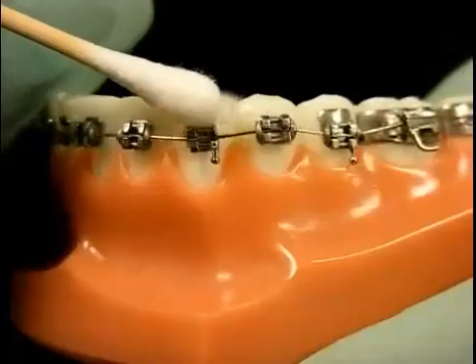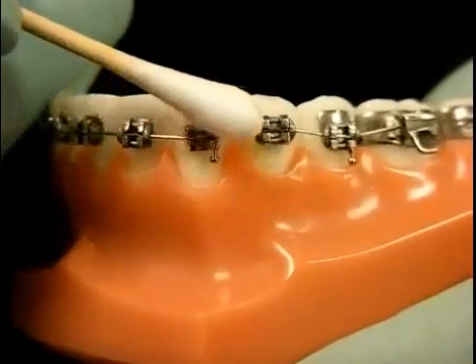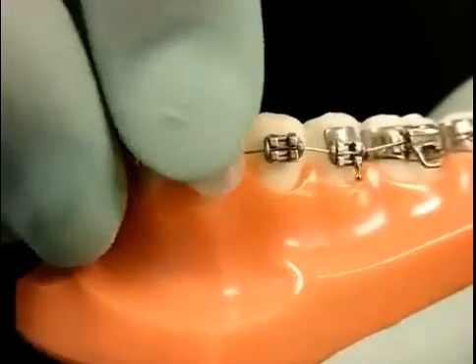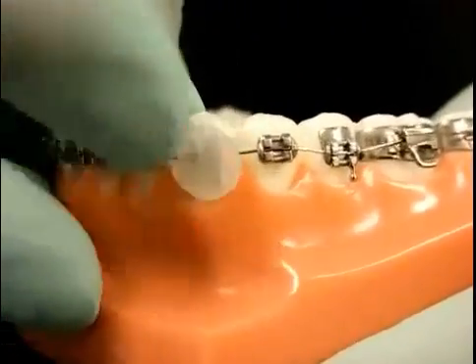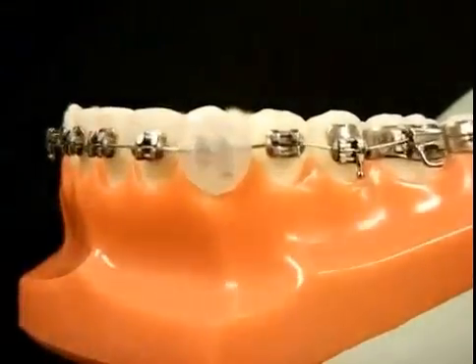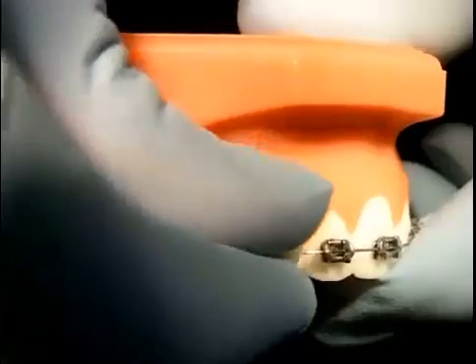To place wax, break off a piece and roll it into a pea-sized ball. To get the wax to stick, dry the area with a cotton swab and then press the ball of wax over the area of irritation. Mold the wax with your fingers until it is smooth. Remove the wax when eating or brushing and reapply as needed.